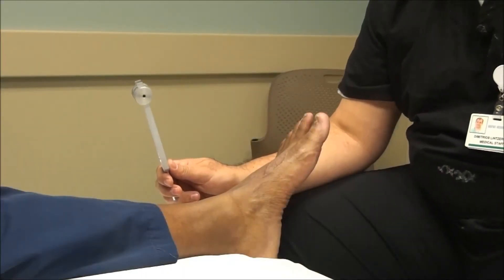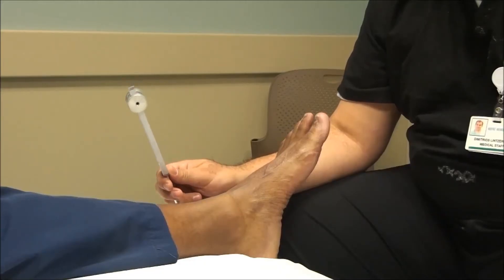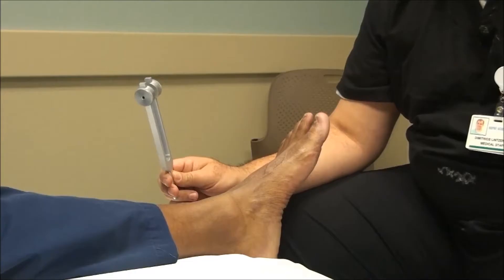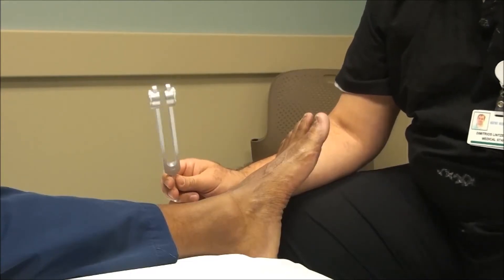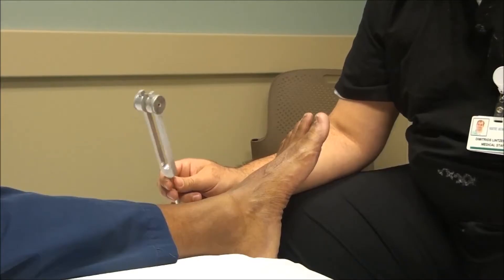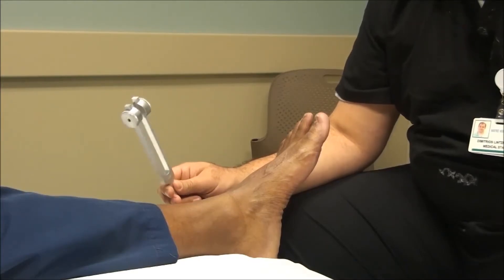This is Dr. Linceras from 360woundcare.com and today I'm going to demonstrate the Tuning Fork Test. This test is performed with a 128 Hz tuning fork. The Tuning Fork Test is another simple, inexpensive test that we can use for loss of protective sensation when examining the diabetic foot.